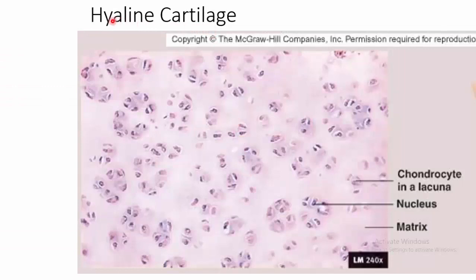Now we start into connective tissue. Connective tissue is made up of cells in a matrix. See all these dark areas? Those are called chondrocytes. They're cartilaginous cells, but then they're in a matrix of collagen and various inorganic salts. So that's hyaline cartilage type of connective tissue.